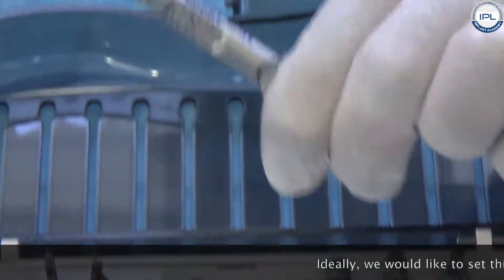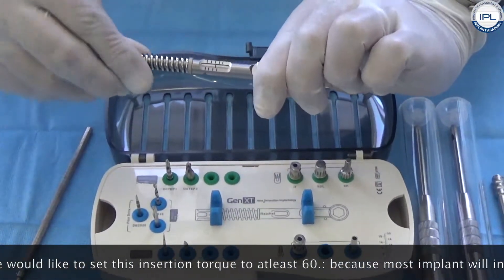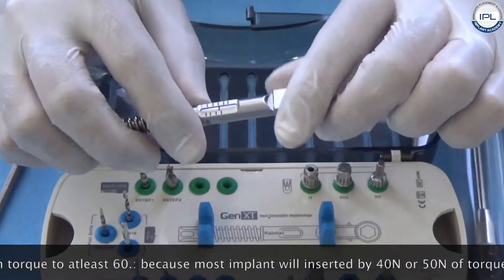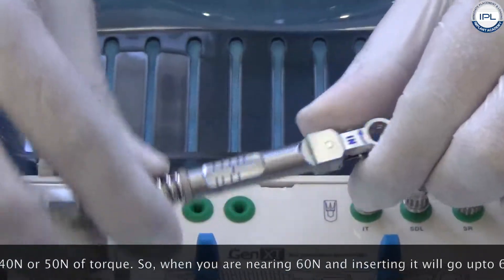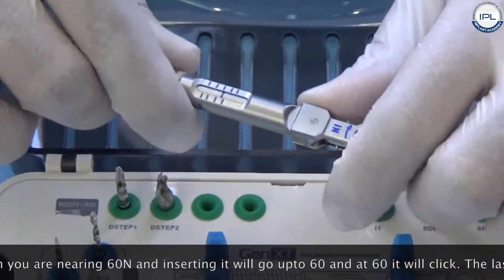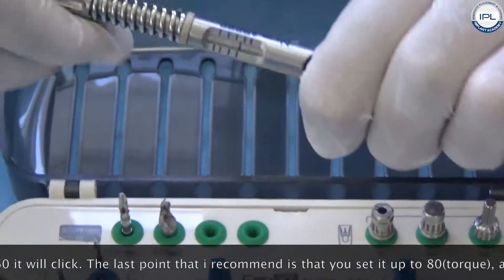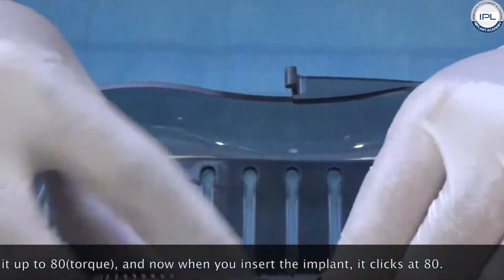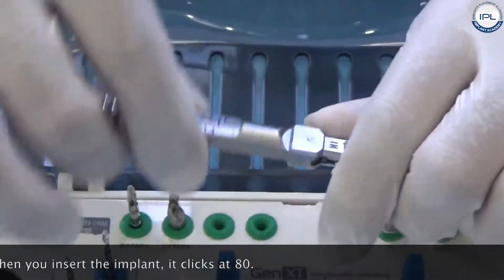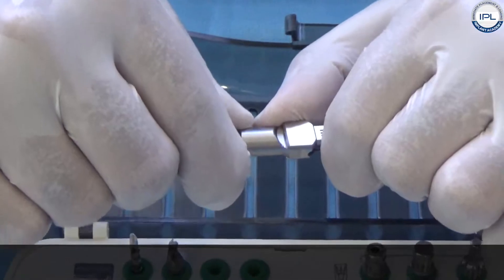Ideally we would like to set this insertion torque at at least 60, because most implants will be inserted by 40 or 50 newtons of torque. So when you are nearing 60 newtons, when you are inserting it will go up to 60 and then at 60 it will click. And finally the last point that I recommend is that you insert it up to 80. You take the torque up to 80, and now when you are inserting the implant and it clicks at 80, you see it's a lot more difficult now.